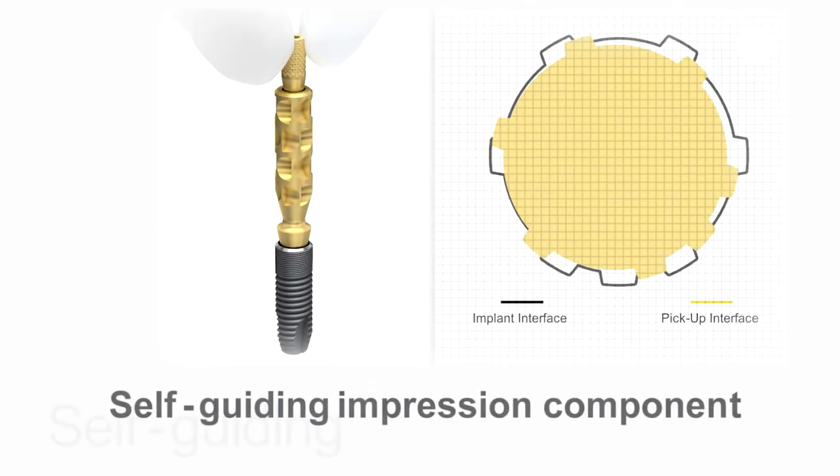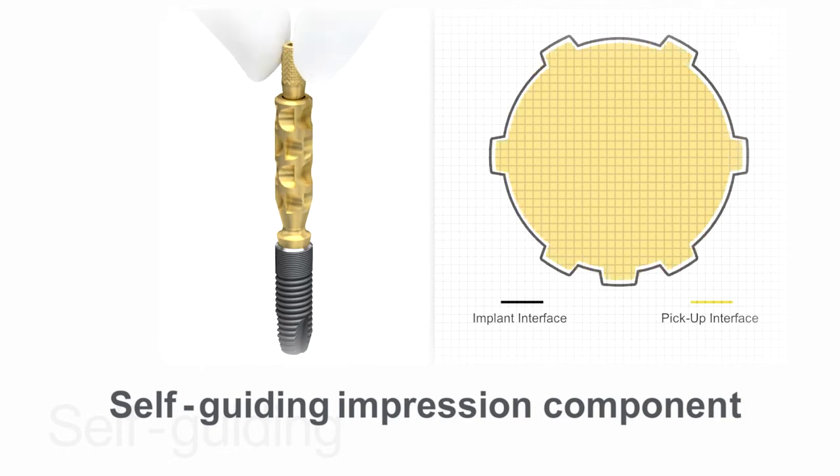To simplify the procedure, the self-guiding impression components can be placed in one position only, and only one hand is required to achieve a predictable and precise seating.